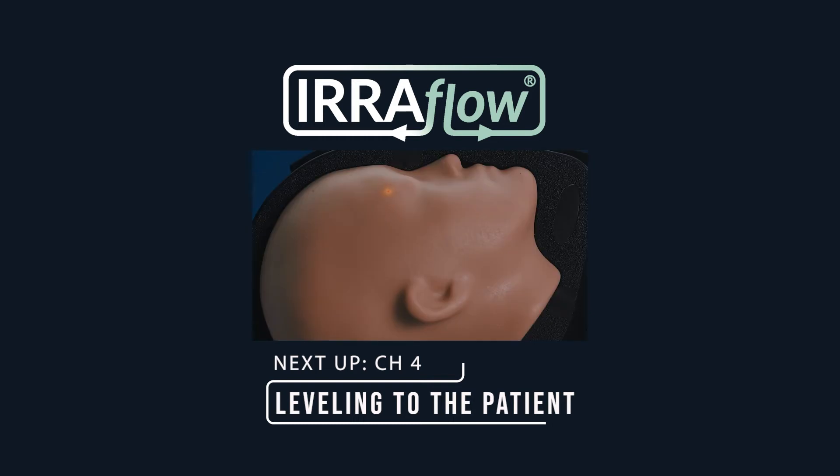If you have additional questions, please reference the IRRAflow instructions for use, download the IRRAS Academy app, or contact your IRRAS sales professional.